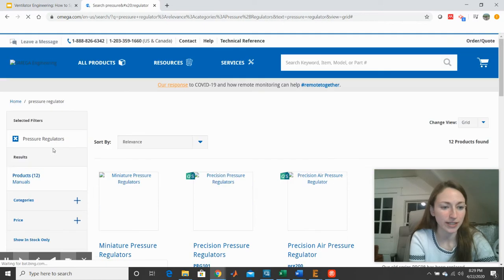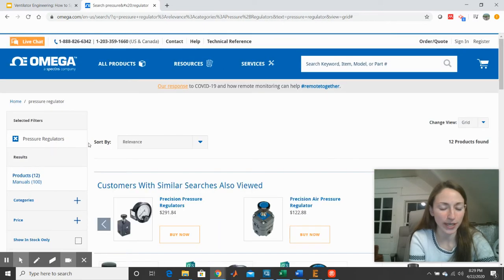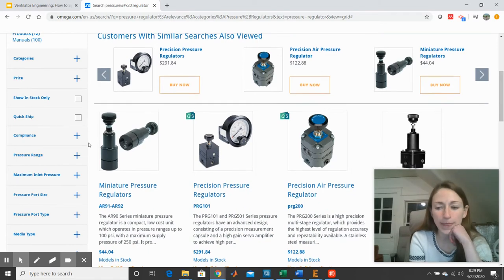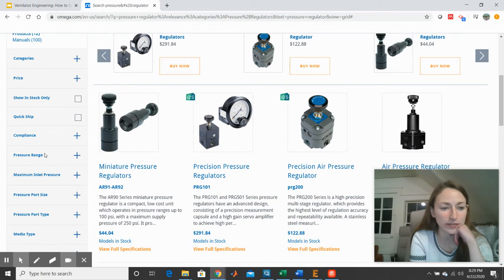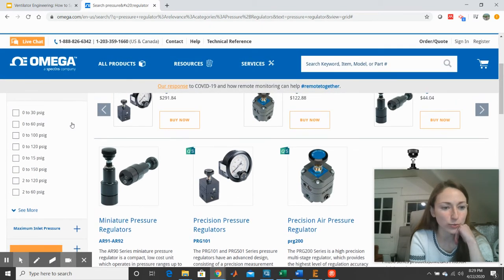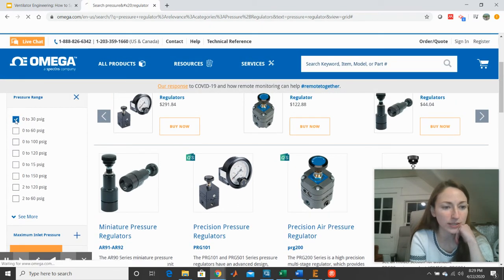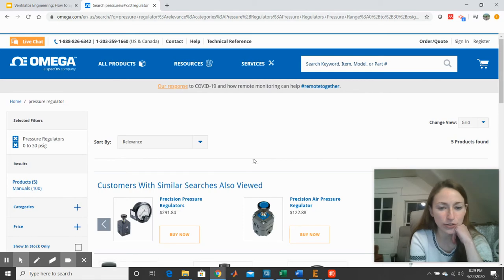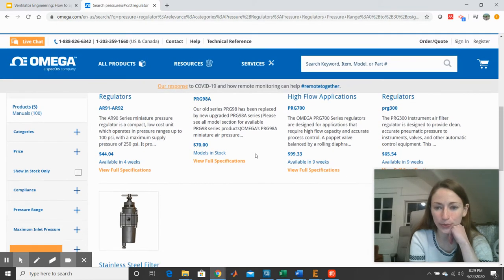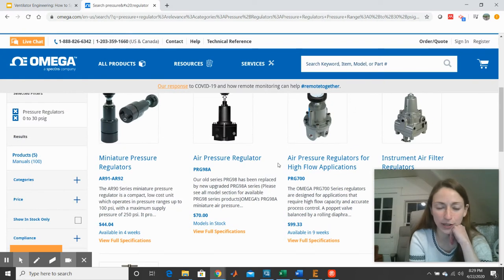So I'm just going to narrow my search down to actual pressure regulators. And since we are working within a pretty specific pressure regime, I'm going to try to narrow that down as well. So I'm going to pick one of these lower end restrictions, and I've dropped my search down to just a few categories of parts here, right?